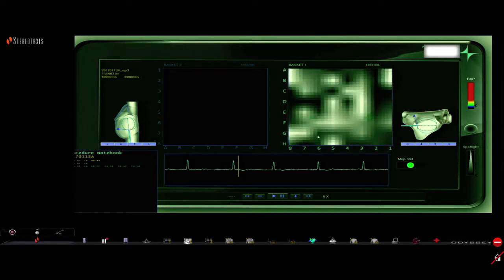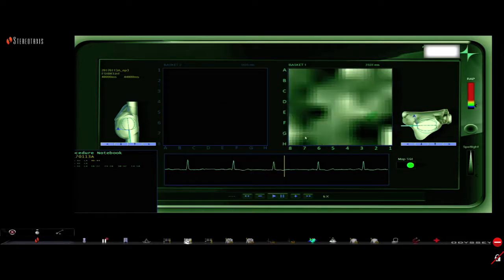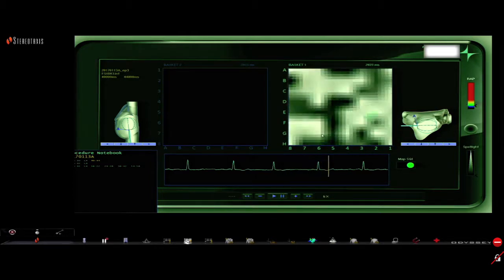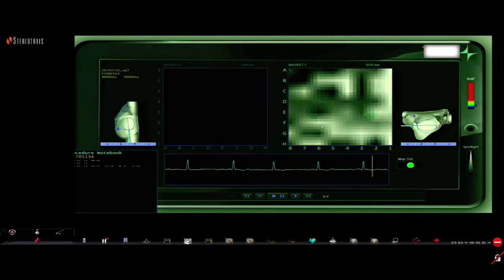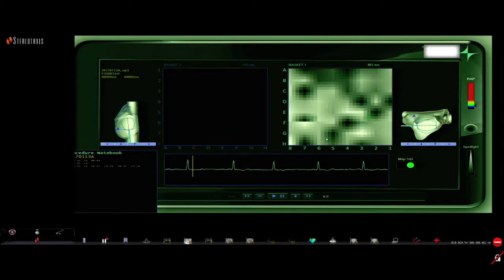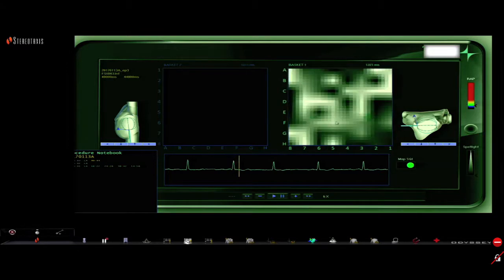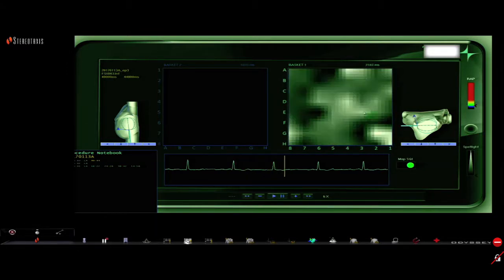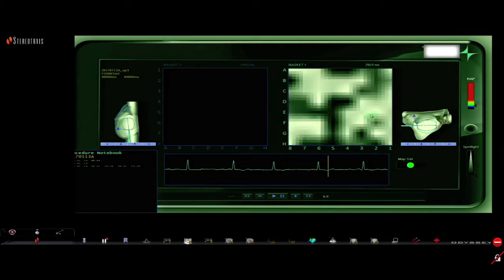There was wrap down here on the initial map, I'm sorry if I didn't make that more clear. This confirms what we're seeing, that there isn't much more rotation in this area, that everything is incomplete rather than full rotations. There does seem to be another area that appears to have a consistent rotation.